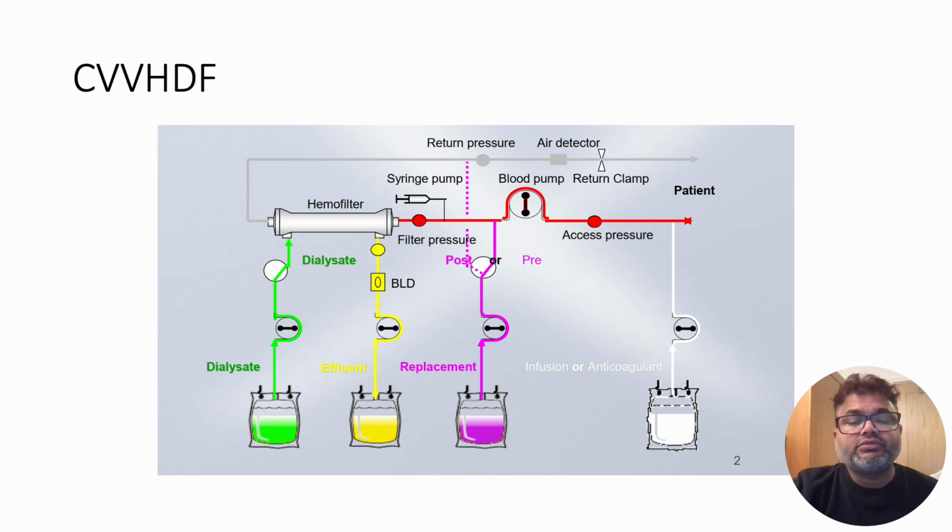I have tried to be as simple as possible to explain the mechanism of different modes of CRRT.